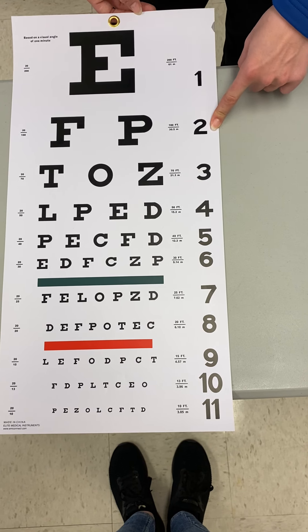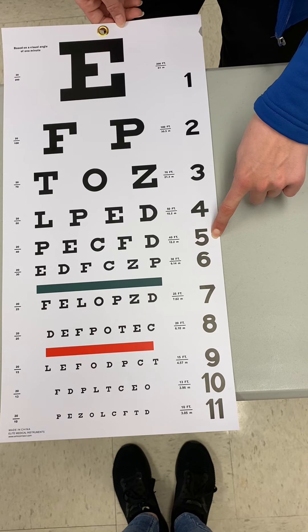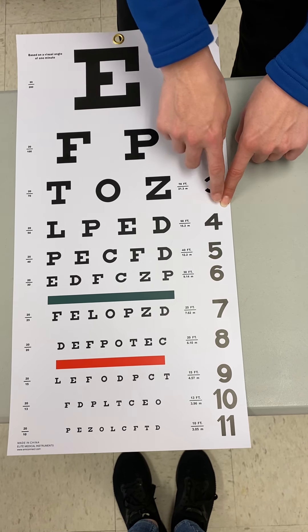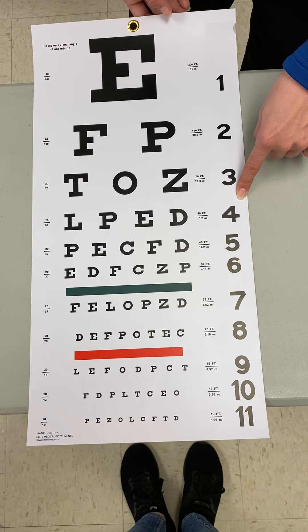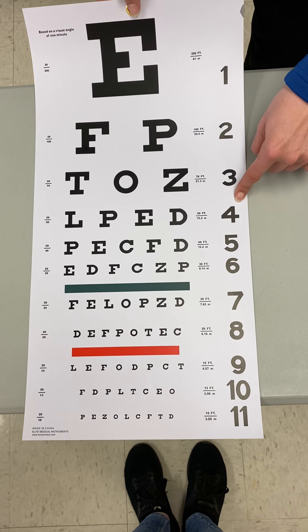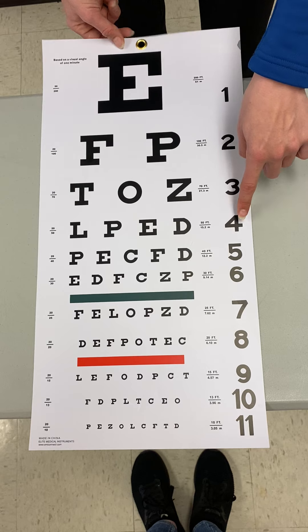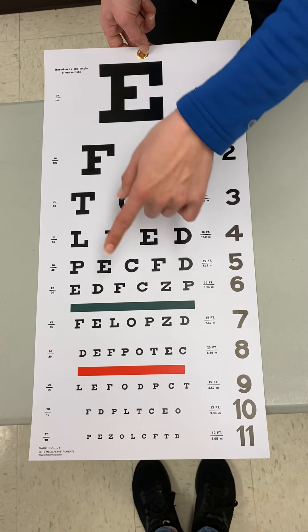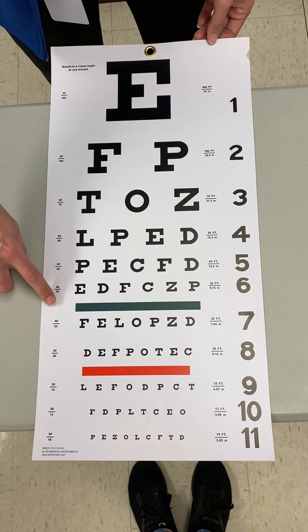With the line numbers, I can say 'read line five please' and they know which line to read. You'll also notice that all of the numbers are in the same size as line four, which is one of the more common lines that patients are able to read during a distance vision screening test. By being that size all the way down, we can ensure they'll know which line we're talking about.